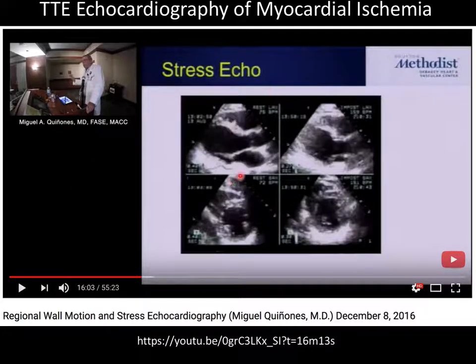So here's a really good YouTube description of what stress echocardiography is, and we can describe it quite quickly here. In stress echocardiography, recall that ischemia is usually induced by asking the heart, or asking the vessels, to provide more blood flow than the baseline.